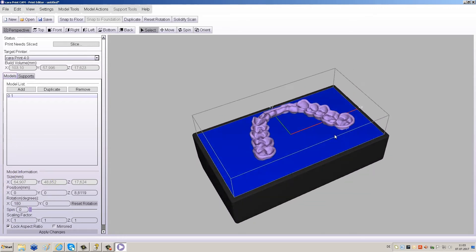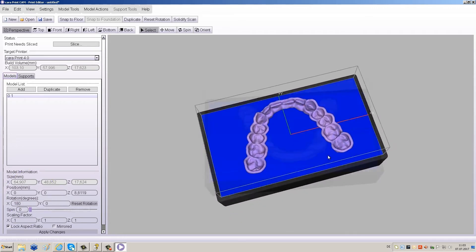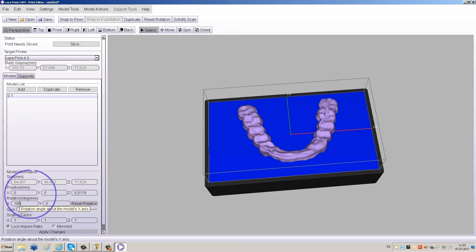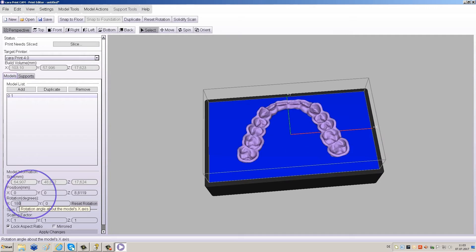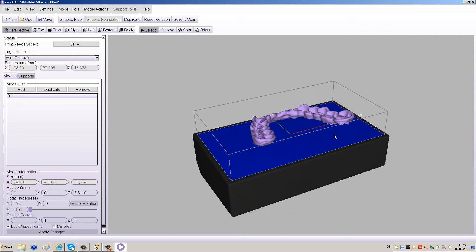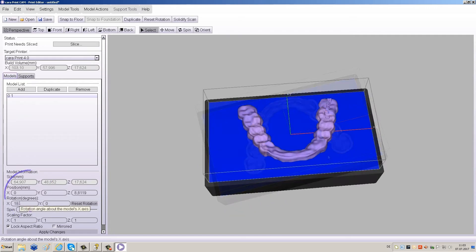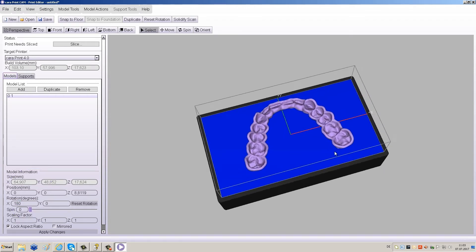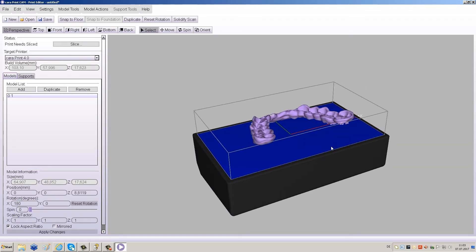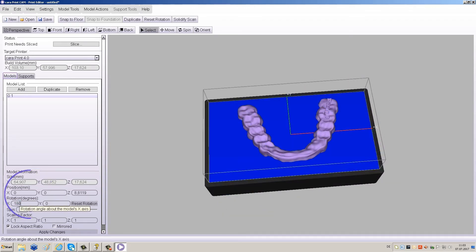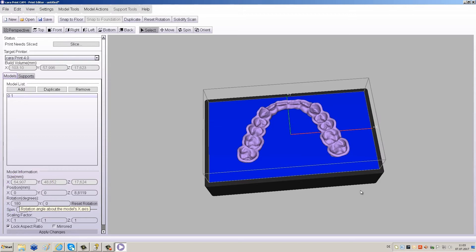Note that supports will not be generated on the cavity side when you flip the restoration by 180 degrees. For further processing, it's easier to remove the supports when you place them on the occlusal side.